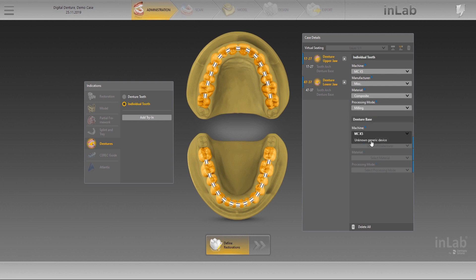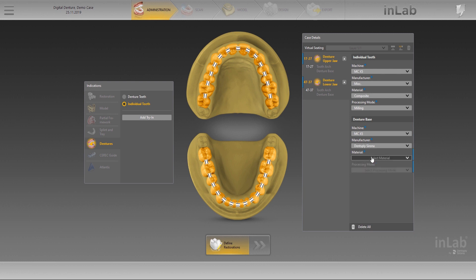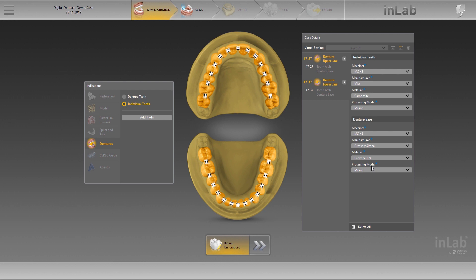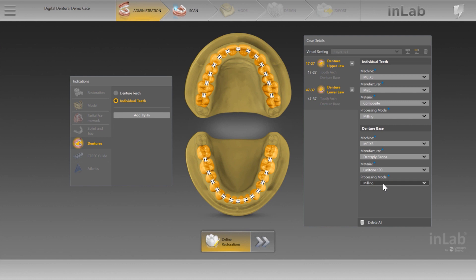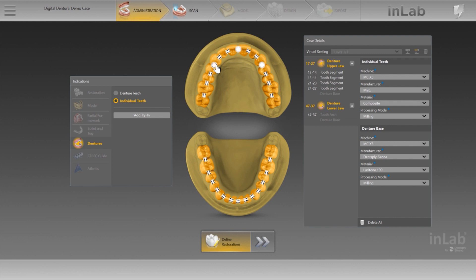Specify the machine, material manufacturer, and processing mode for the denture. Mandatory entries are marked with a blue bar. For a denture with individual teeth, the connectors between the teeth are automatically placed. Connectors can be deleted and added by left-clicking and right-clicking, respectively, in the dental chart.